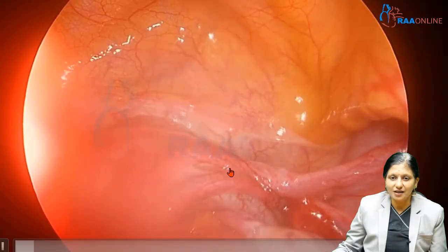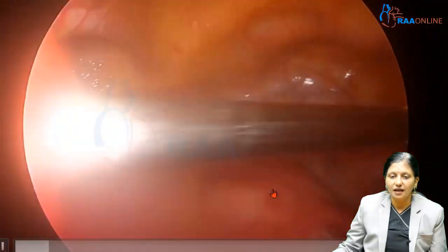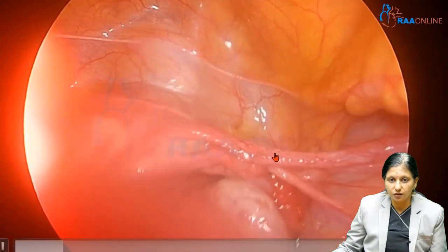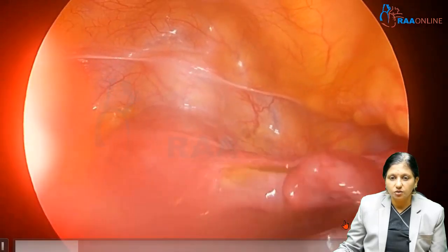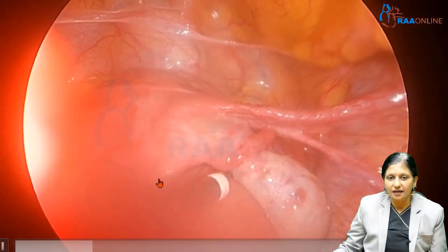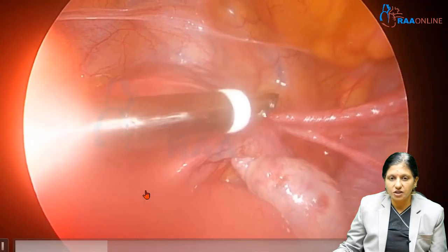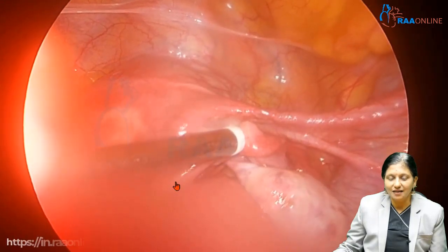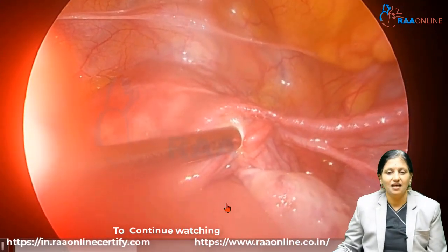Here we are seeing the uterus, the round ligament, the fallopian tube, and the ovary. This is the ring applicator inserted through the 7 mm port. The tube is identified by its fimbrial end. We visualize the tube in its entirety — the ring should be applied at least 2 to 3 centimeters away from the uterotubal junction. With the applicator open, we create the loop and shoot the ring, so that a 2.5 centimeter loop goes inside the ring applicator.